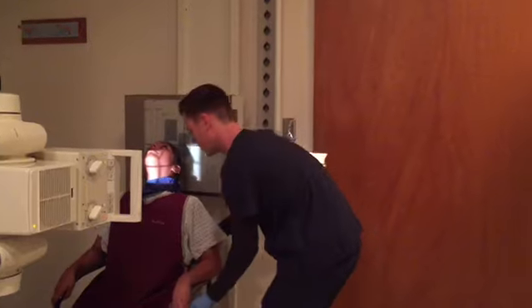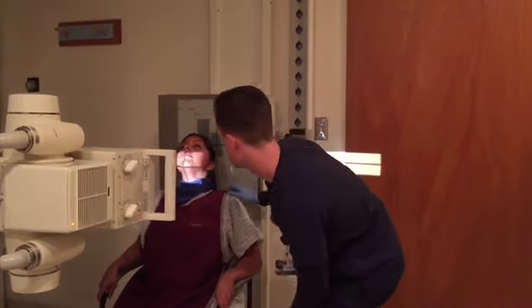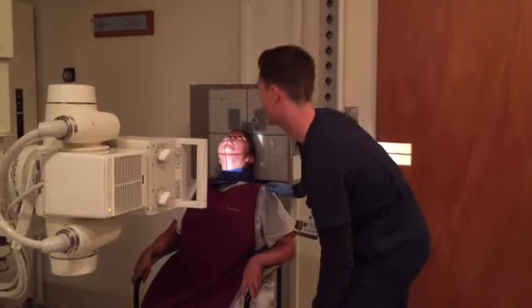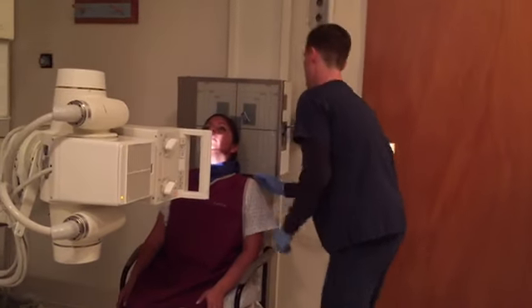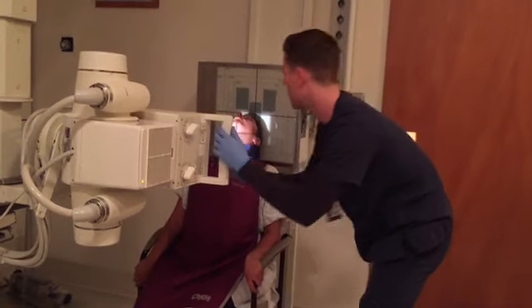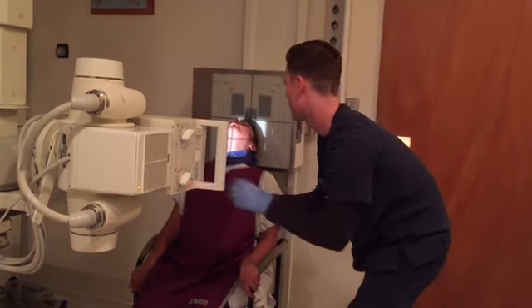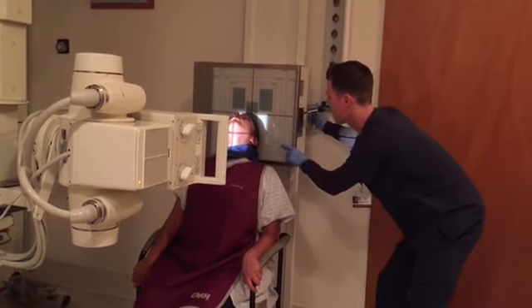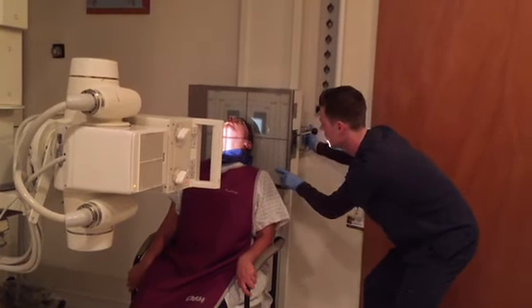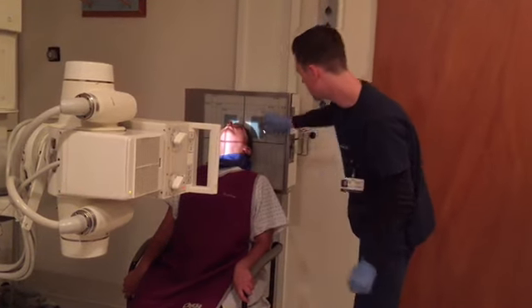Have you scoot this way a little bit, towards me. Put your head back. That's better. Okay. So head back, top of the head up against the cassette. I'm going to line up here. It's going to enter between the gonions. Right about there. Adjust my marker. About there. I'm going to mark her left side.